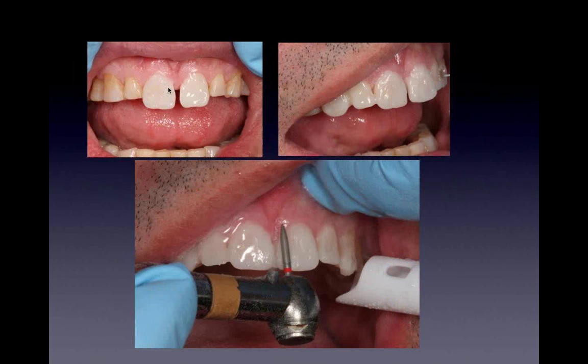I start with the flowables, and I start adding the flowable. He wants to keep a little bit of diastema, so I start with the flowables, and then I just start recontouring. This is all freehand, and we teach this at our course. We do a lot of hands-on provisionals, something none of us were taught in dental school. Hands-on provisional is a wonderful technique to learn to get your mind, your eye, and your hands to a wonderful position where you can start really creating smiles. That's something you need to learn. You need to watch how it's done to really learn it.